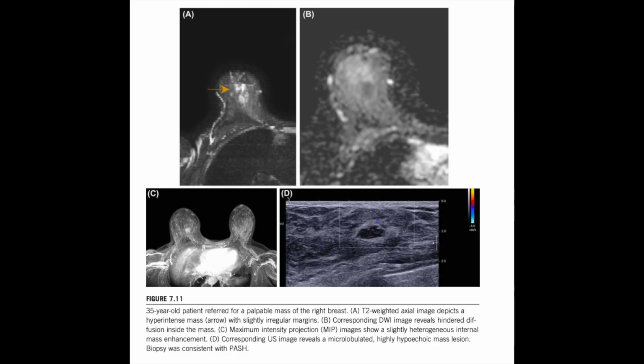So after a patient has had surgery, a lumpectomy or something similar, the scar tissue can create a whole new set of benign findings that can really complicate future MRIs. Right, and the most common one is fat necrosis. Which is? It's just inflammation that happens after an injury to fat cells.